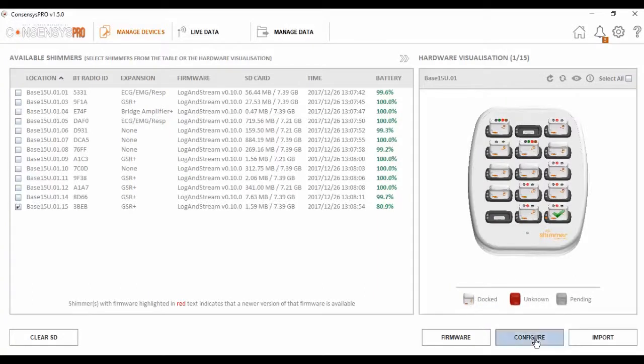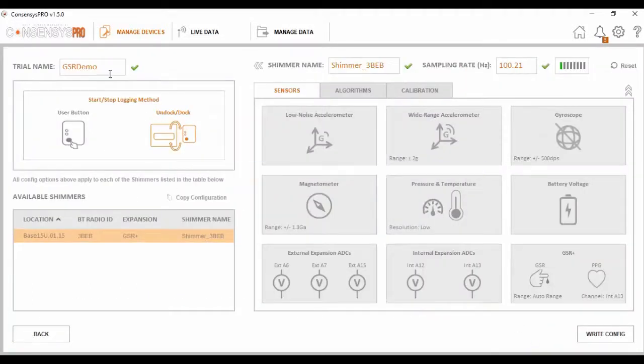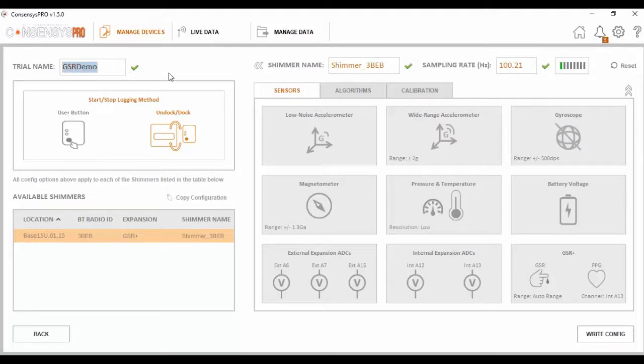Next we must configure this unit. First thing I want to do is set a unique trial name.